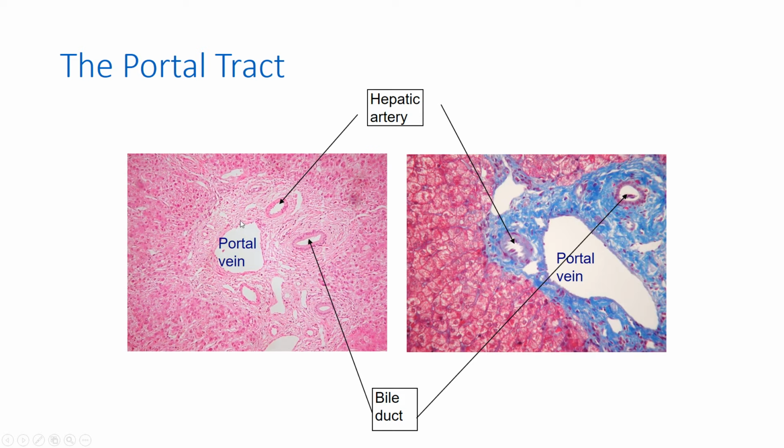I call these the fraternal twins. I'm sure the more senior residents have heard me say this, but why fraternal twins? Because they're similar, more or less, in size. The direction is the same, and they're adjacent to each other.